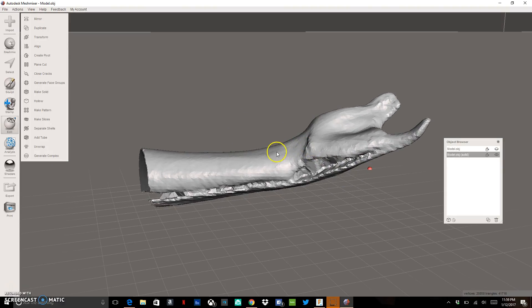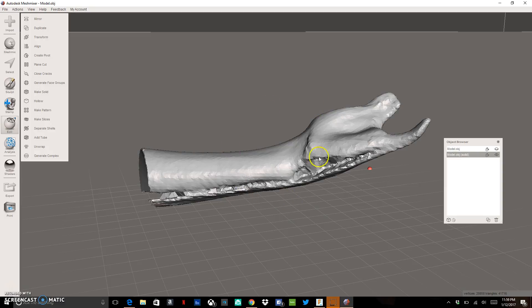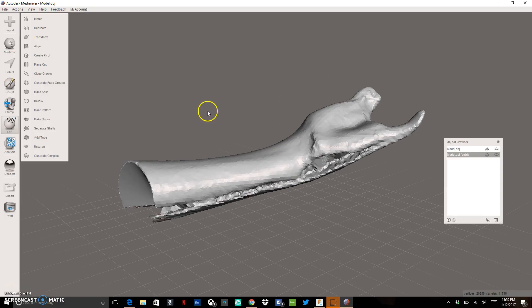So I don't really need any of this portion of the arm that's down here. All I really need is this hand part and a little bit of the wrist to do my modeling in Fusion. So to do that, I can actually use this plane cut feature.